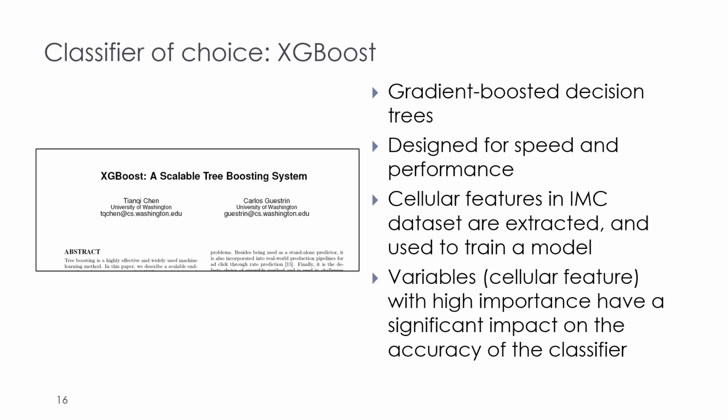So intuitively, one practical application we wanted to investigate of our spatially augmented cells was the ability to predict patients' cause of transplant rejection. Our intent was not so much to compete with the existing diagnostic standards of care, but rather train a classifier to predict the patient's rejection category and identify which spatial features played the most important role.